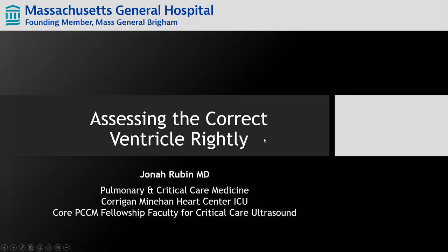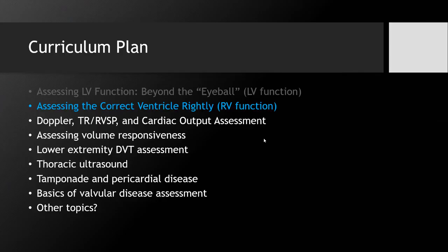Today, we're talking about using POCUS to assess the right ventricle. And this is the second lecture in our series. The first was on LV function, and this will be on RV function, building on what we've talked about previously.